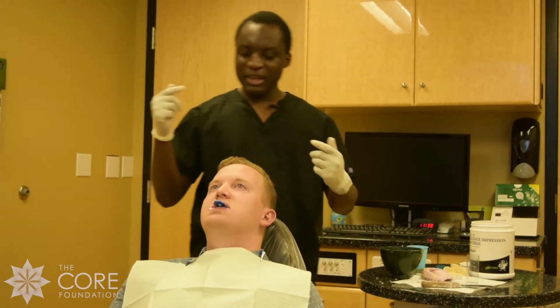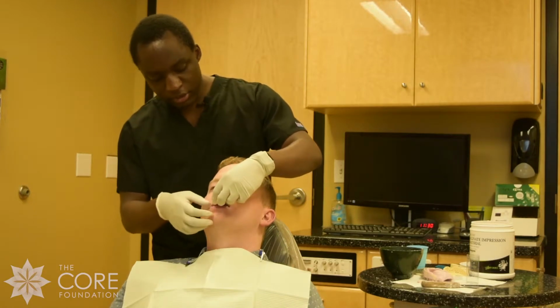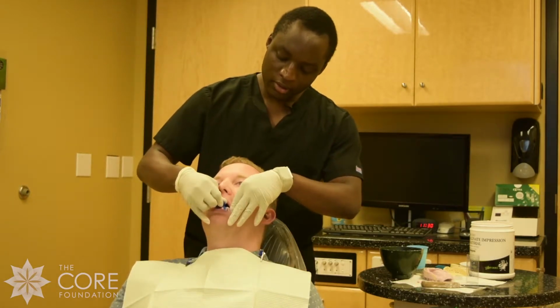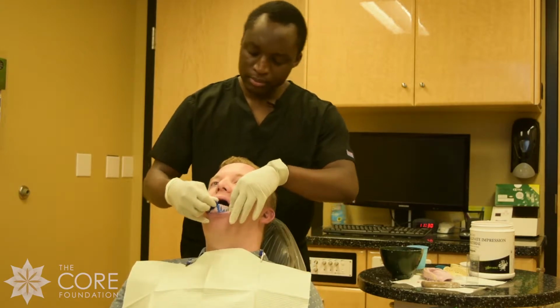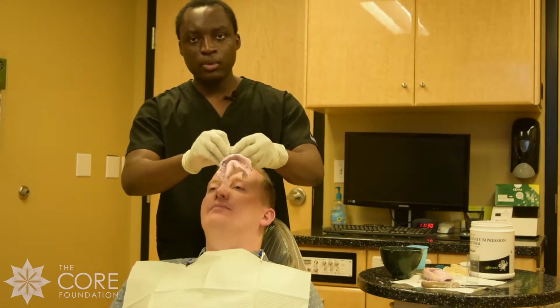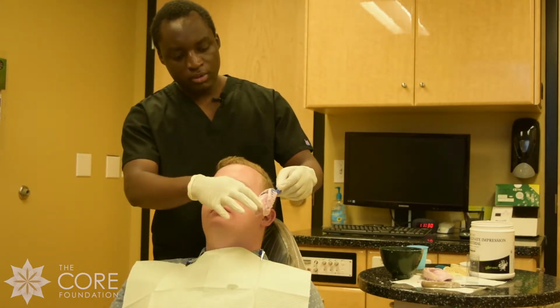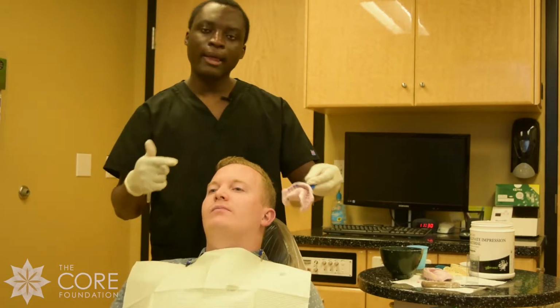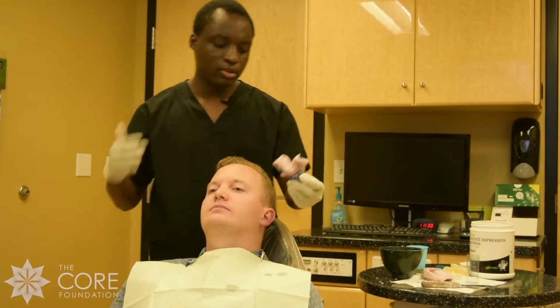All right, guys, it's been about 45 seconds. I am going to check. This is really set and hard, so we'll pull it back up. And then when you look at it, you see you have all the teeth. We have a nice ridge all around it. Again, this is a good impression to use.